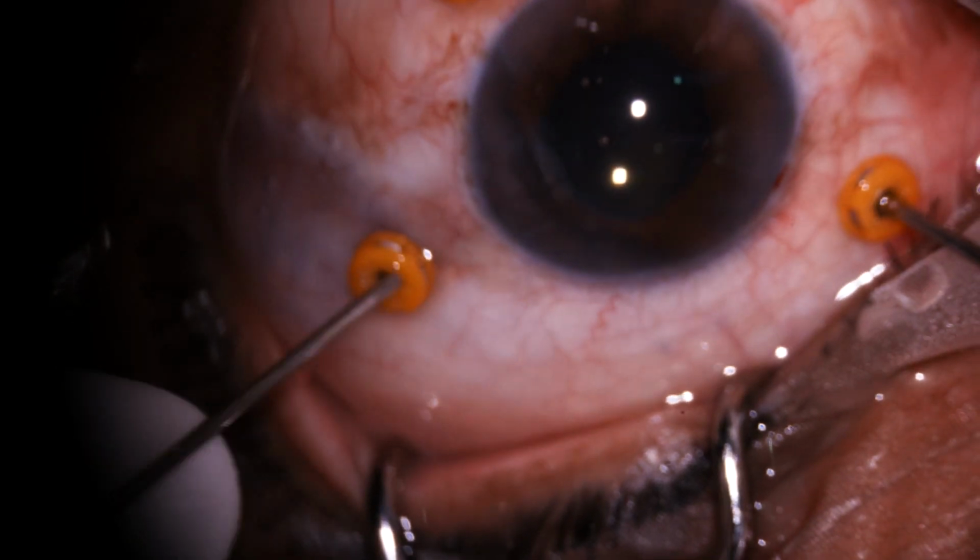In the second scenario, a 3-port pars plana vitrectomy has been done, followed by a core vitrectomy and completion of a PVD. A further membrane dissection from the posterior pole with the help of an intravitreal forceps and completed using a 23 gauge vitrectomy cutter.